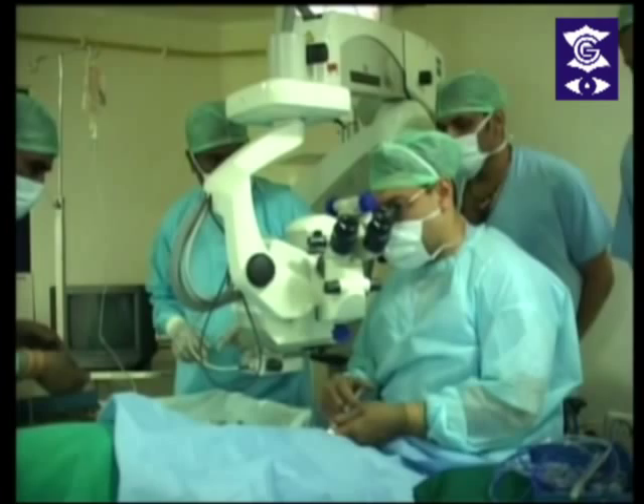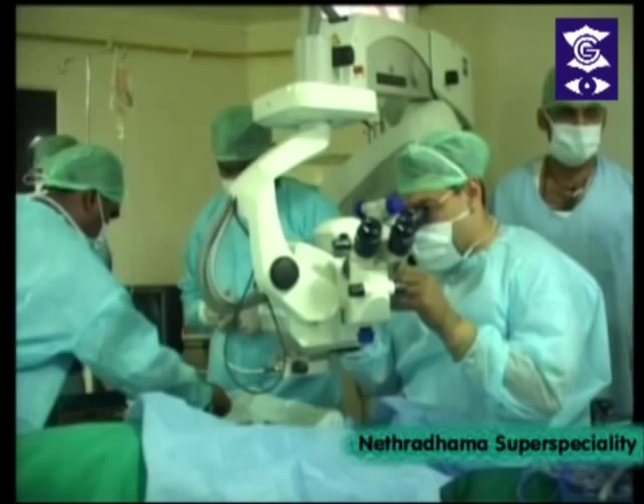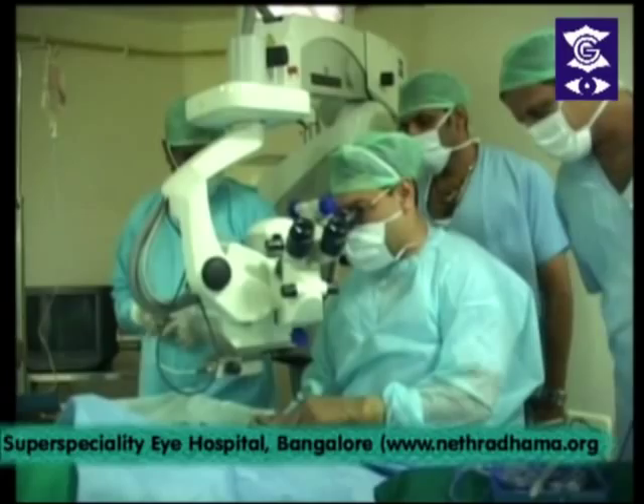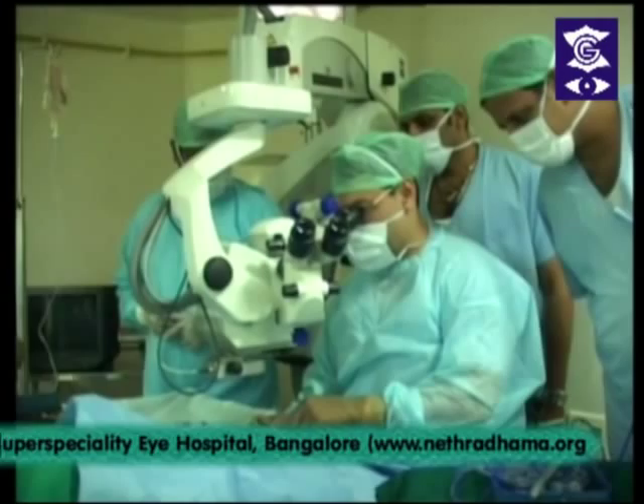He has presented more than 250 instruction courses, papers, and videos at meetings around the world in the USA, Europe, Russia, and the Far East in the last 10 years. He'll be implanting a Zeiss MICS lens and he'll be using the Vizales 500 machine.